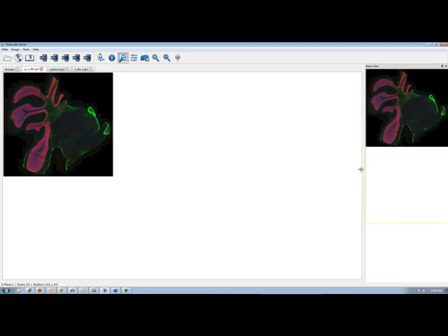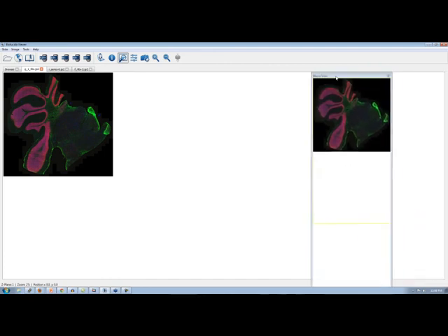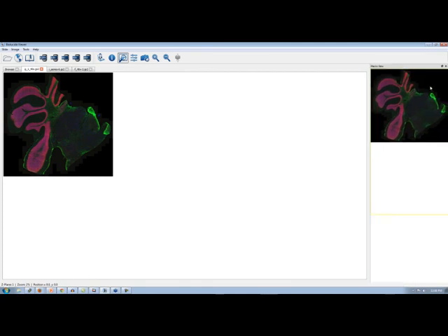So as you can see, we'll just show the docking and redocking here, just as you'd expect one of those to do. Now, the macro view, as we're showing here, can obviously also be used to navigate around images. So why don't we just take a few minutes here and show people how exactly you might navigate around an image. Sure. So the first thing we're going to look at is zooming. And there are actually 3 different ways that you can zoom on an image.